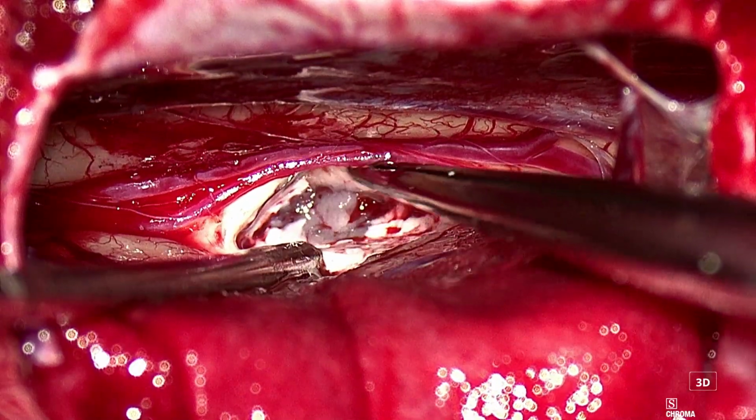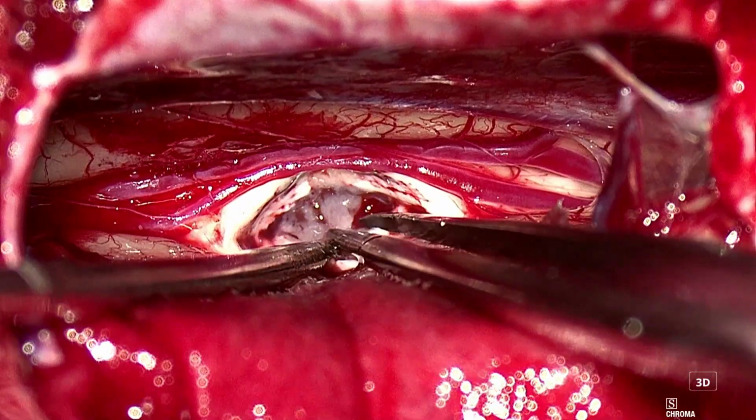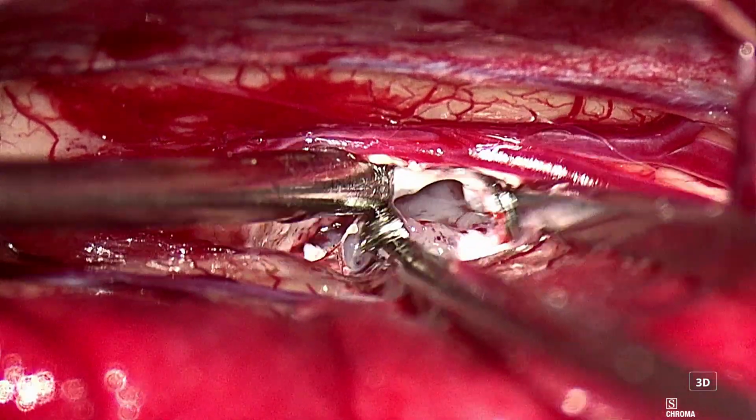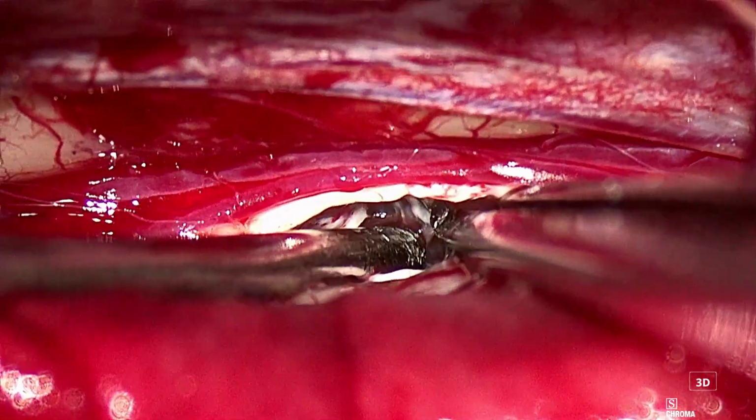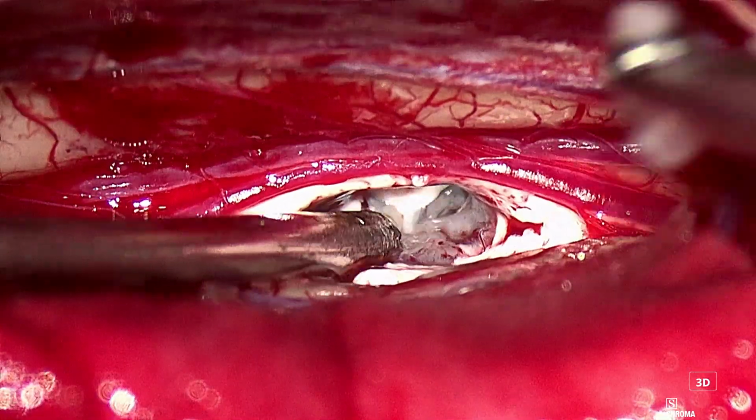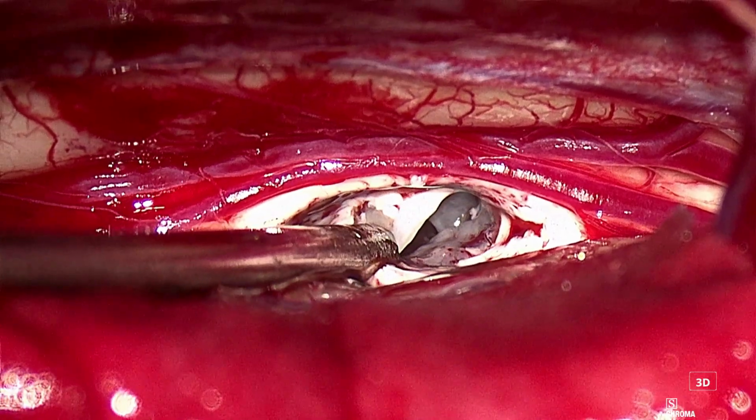The tumor was identified in the right lateral ventricle. It was grayish, mildly vascular, partly suckable, with a poor plane of cleavage. The tumor tissue was removed piecemeal.